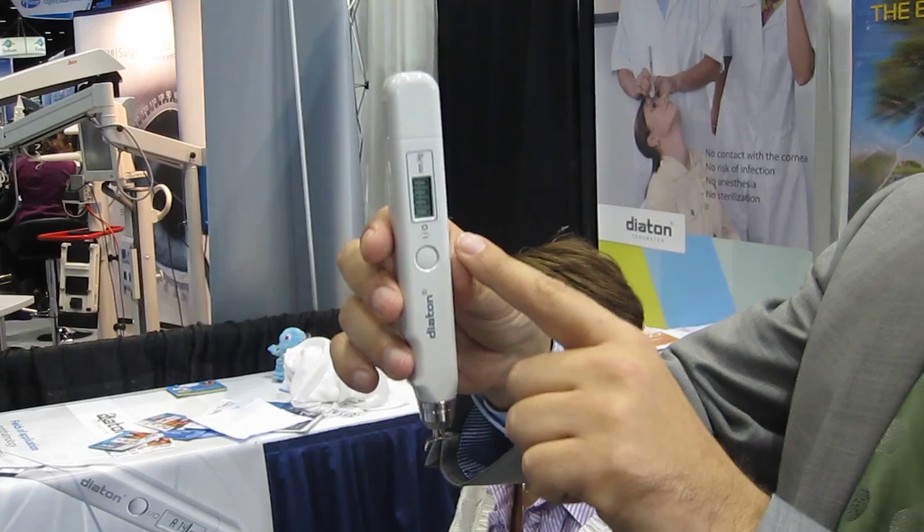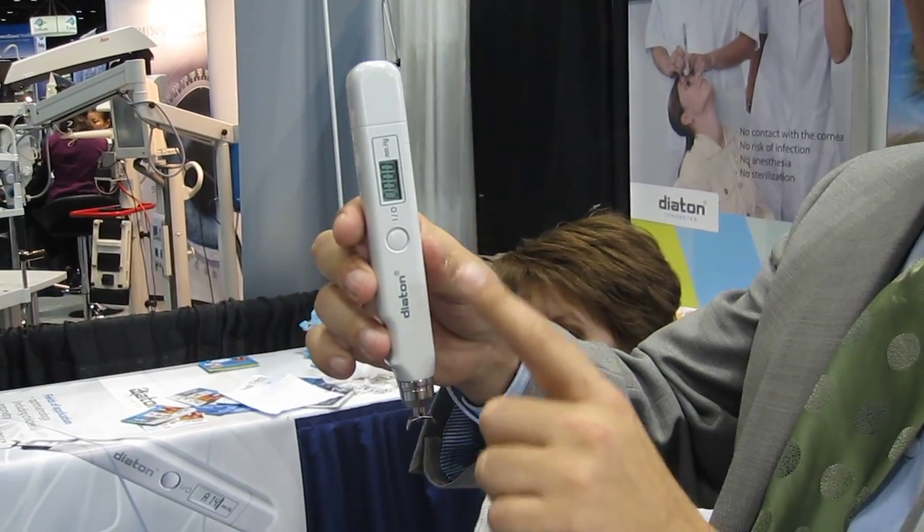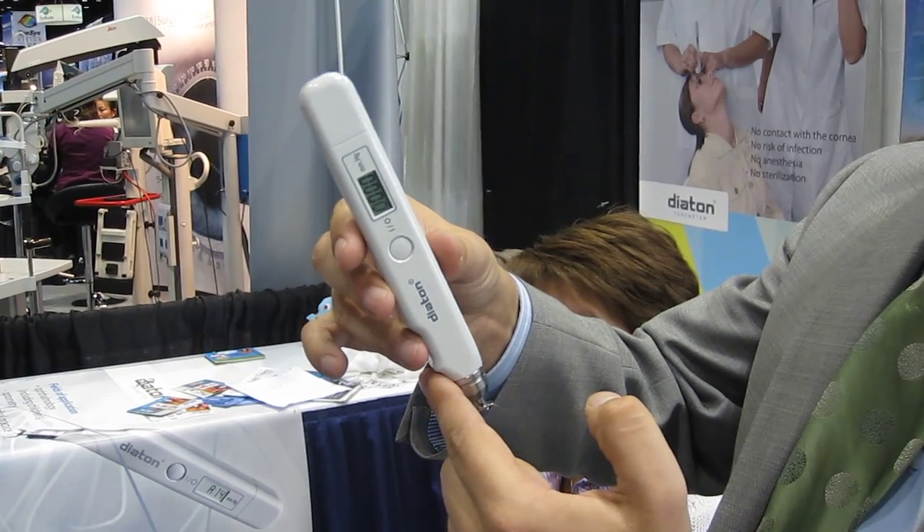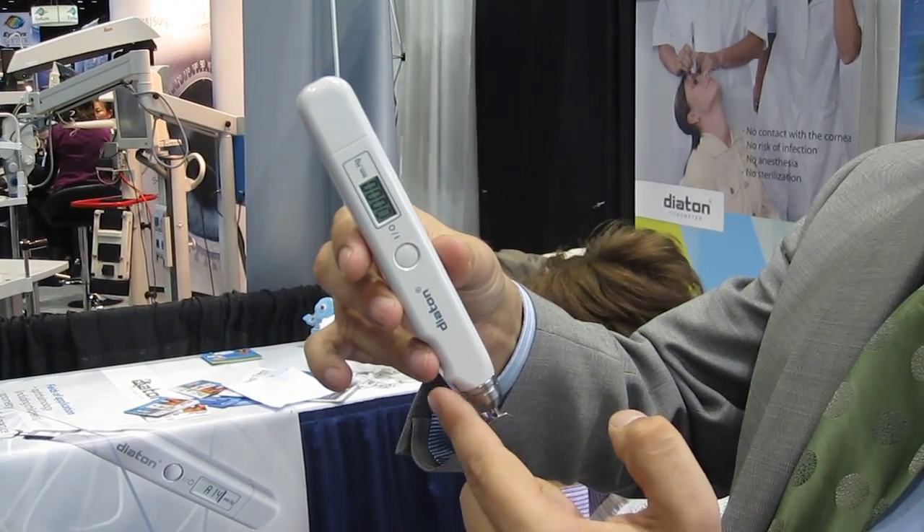There's a beeping sound that serves as an indicator for the user to find the vertical position. When you're vertical, the beeping stops. When you deviate from the vertical position, you have a beeping sound.